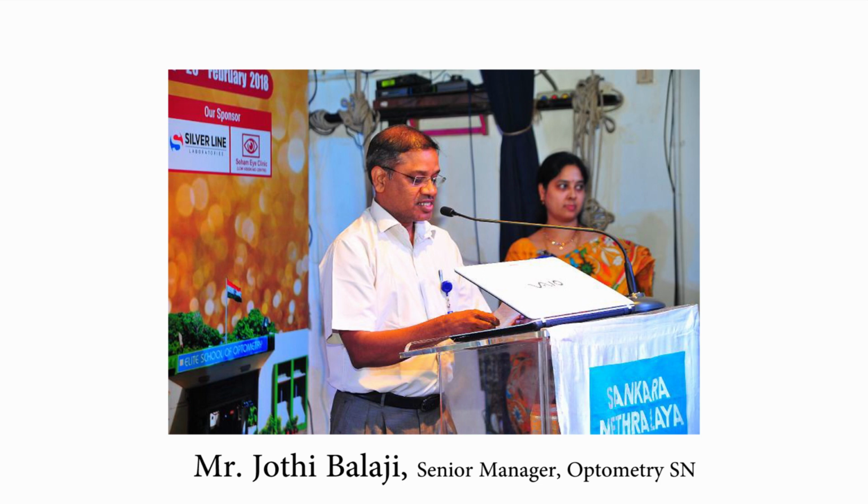When we looked, not much work has been done on how this image can be restored. The only way people are talking about is to take multiple readings, either manually averaging them or coming up with an automated repositioning algorithm and recalculating. But at present, none of this is available with the inbuilt software. So this is the little experience I can share at this moment. This work was presented in a recent Indian Myopia conference, and it won the Best Paper Award.